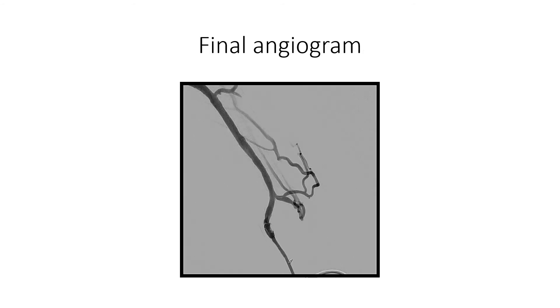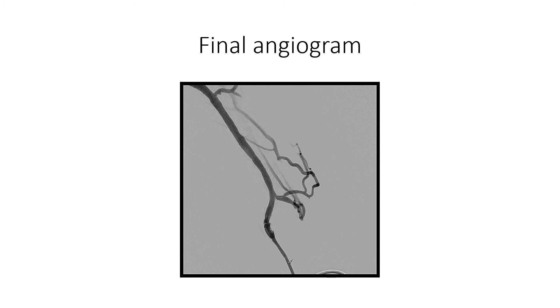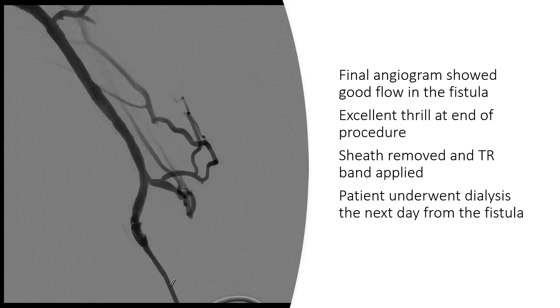With all that we got an excellent final result. You can see good flow in the vein at the end of the procedure. Clinically the patient had an excellent thrill. The sheath was removed and the TR band was applied for hemostasis as we normally do. The patient was able to undergo dialysis the next day from the fistula.